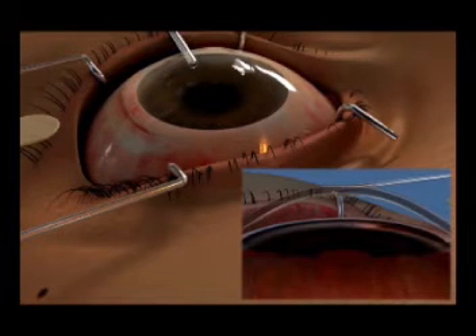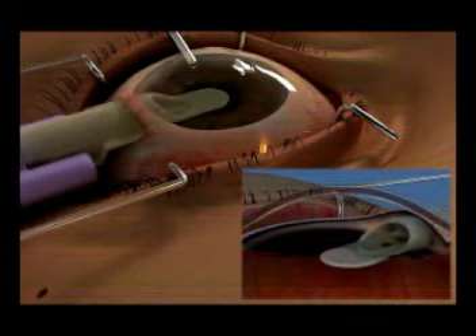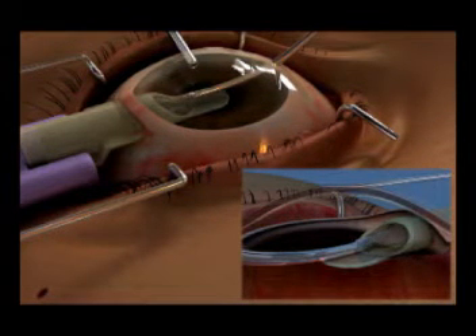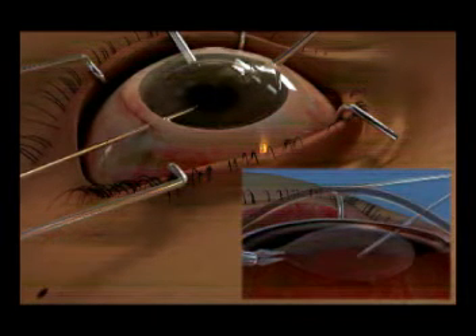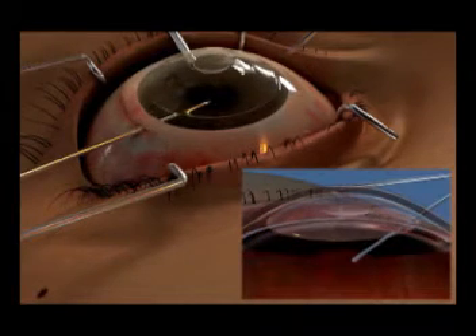With an AC maintainer on to stabilize the chamber, the Endoglide is fully inserted through the 4mm sclerotunnel, forming a complete seal of the wound. The SAG forceps, introduced from a nasal paracentesis, then simply grasps the donor and pulls it in. The donor automatically uncoils, and the Endoglide is removed. A small air bubble is then injected beneath the donor to prevent descent onto the iris.